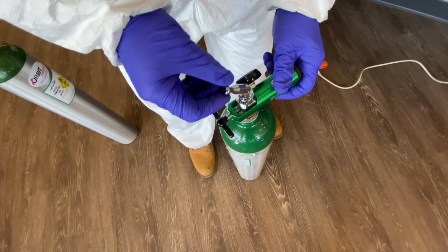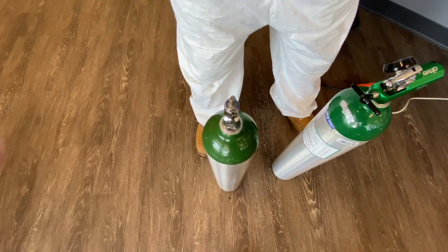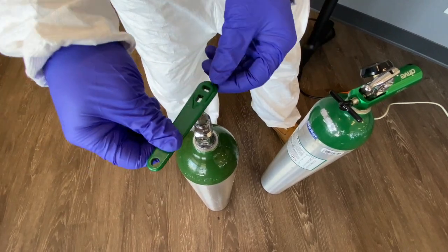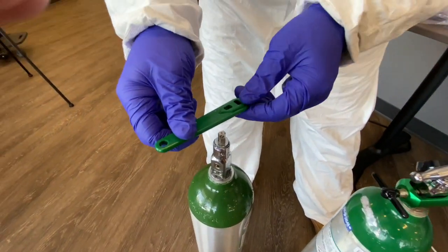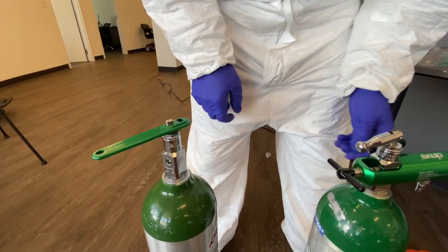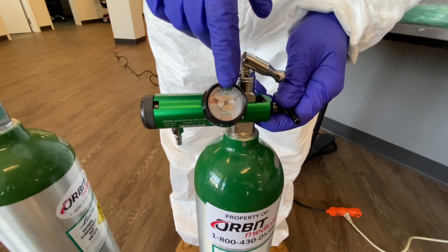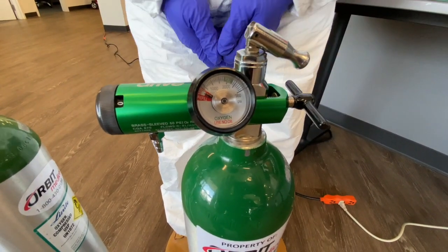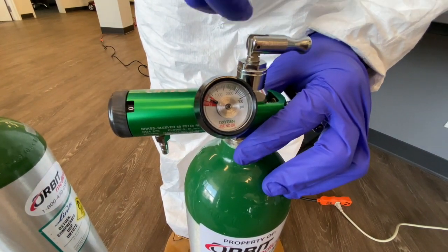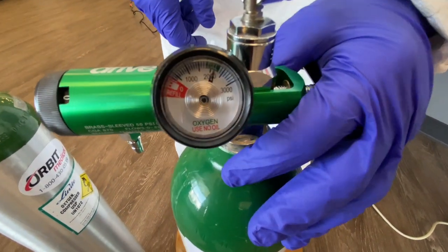Some of our e-tanks come with an integrated key. Right next to me I have an e-tank that doesn't have the integrated key, and that's why we supply you with the plastic ones. If this one doesn't have a key, this slides down and you turn on the tank by turning it counterclockwise. You can see right now it shows the e-tank is empty — we get a lot of calls about the emergency tank being empty. You're going to rotate this counterclockwise, and as you can see the needle moved over to the 2000 PSI mark. All of our e-tanks come at 2000 PSI.